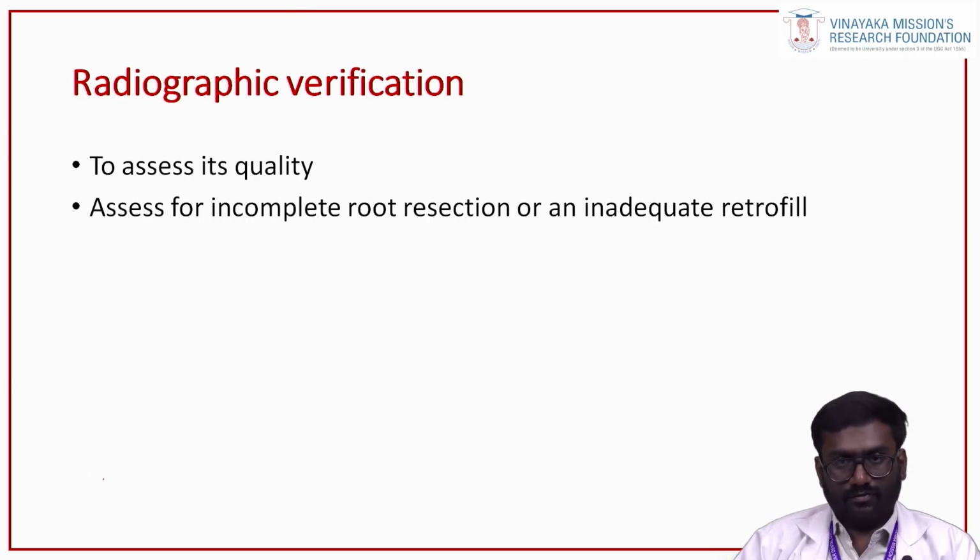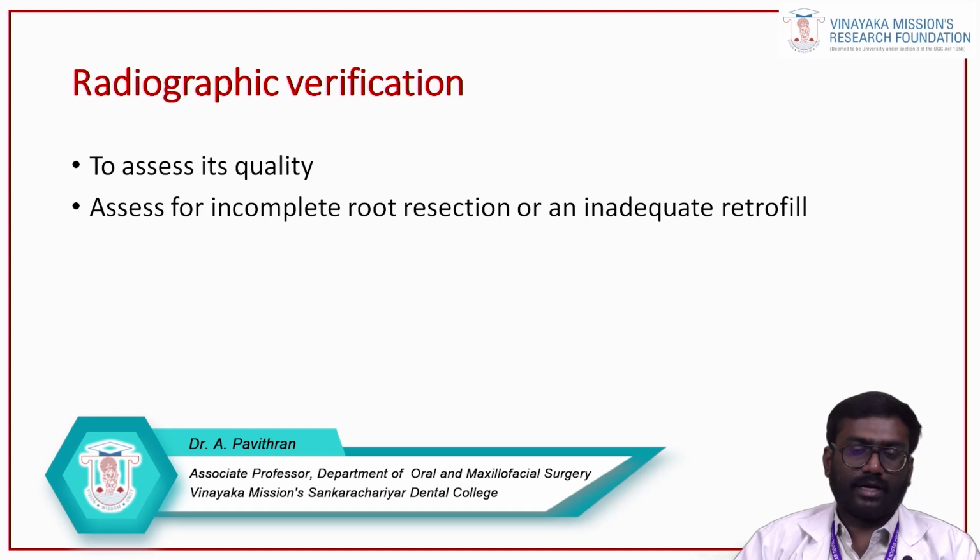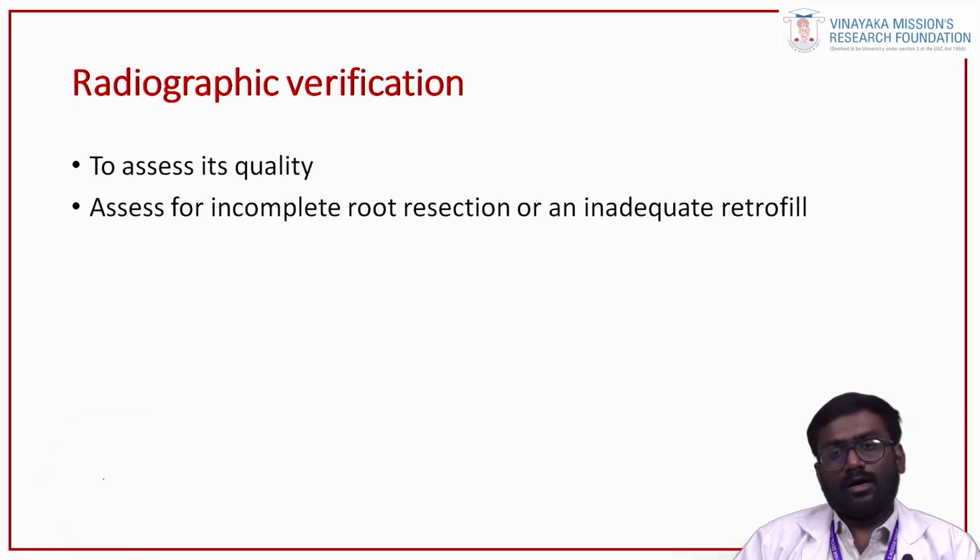So once the retrograde filling is done, you have to verify radiographically whether you have adequately resected the root surface and adequately created a seal in the periapex of that tooth.